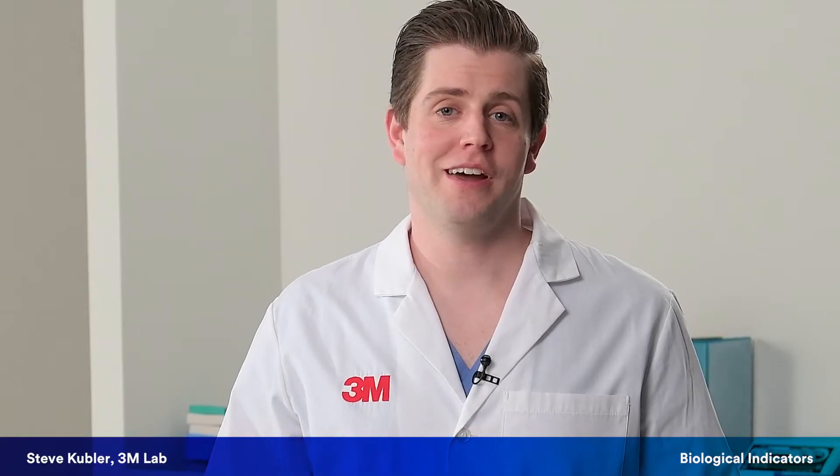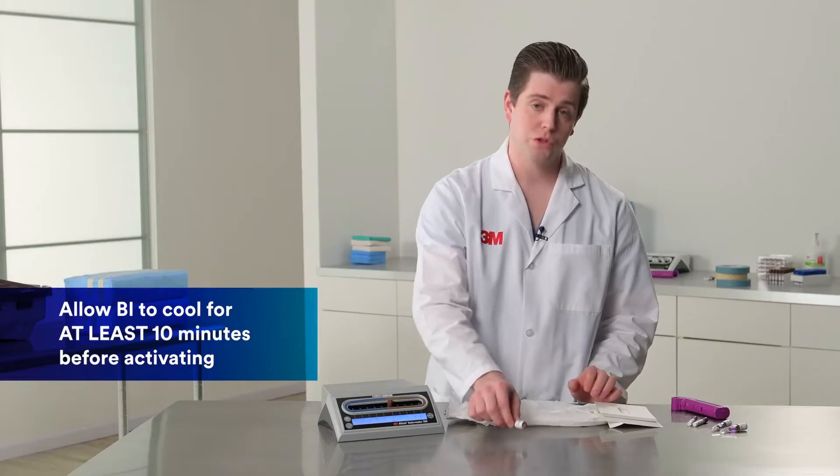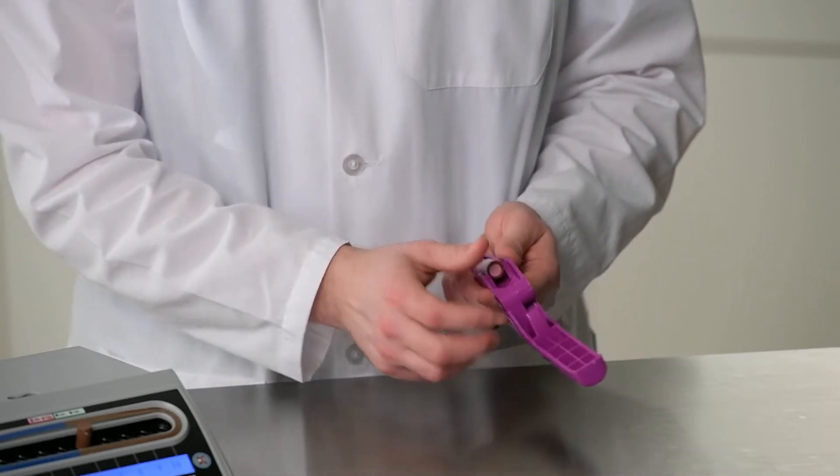Now that we know about the BI, let's talk about how to activate it. Once you remove the BI from its test pack, allow it to cool per the IFU before activating. For super rapid BIs, you want to activate with the 3M handheld activator.